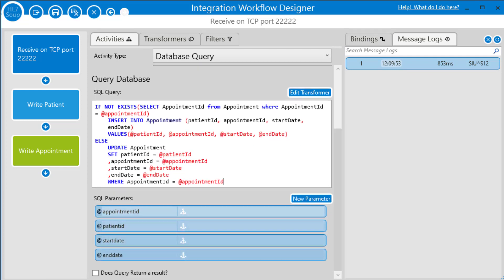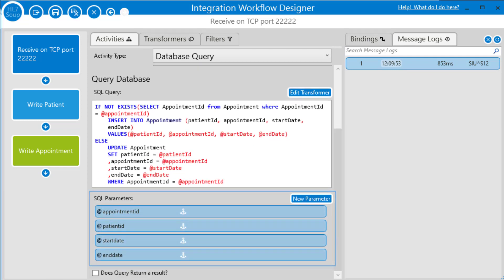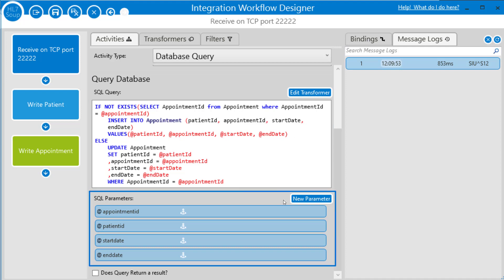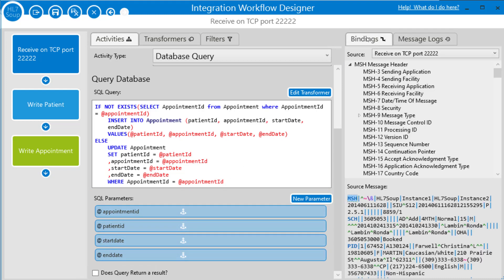And here's what I've written earlier. Again, we are using parameters to get our values. And so here's the query to add the appointment. Similar to the last one. It's checking if it already exists and it updates it if it already does rather than inserts. And it's already got the parameters in place. And you can see the parameters are being populated down here from the query. So now I just need to populate those. And I choose the bindings.